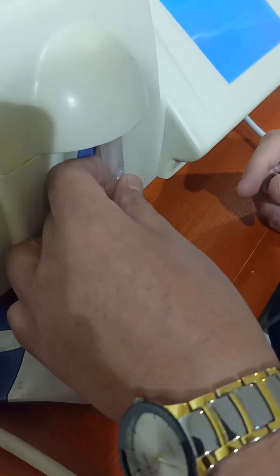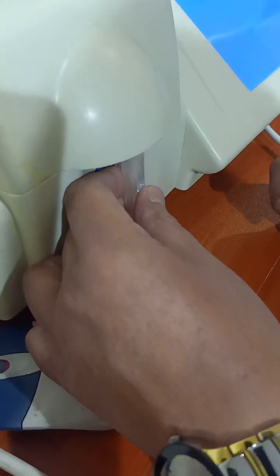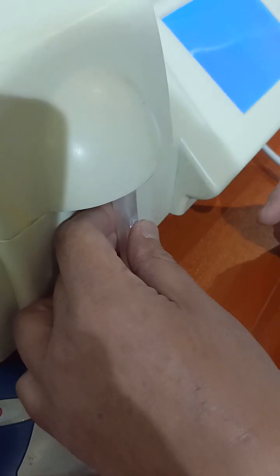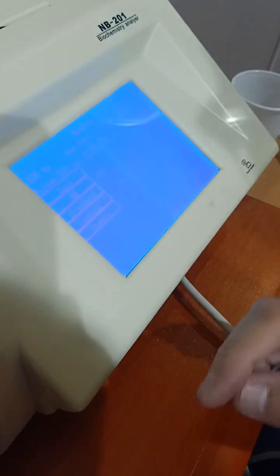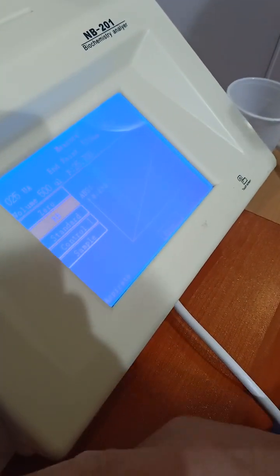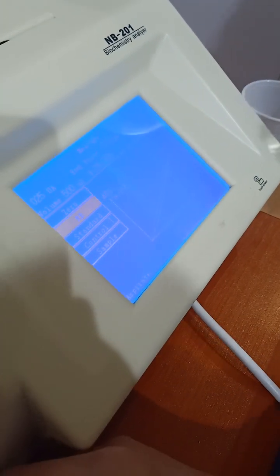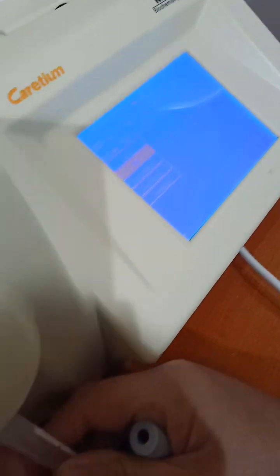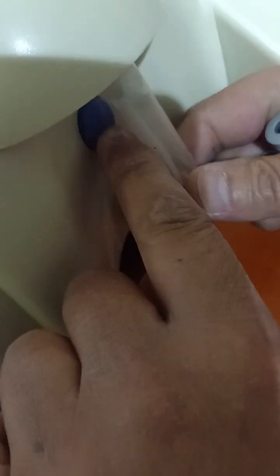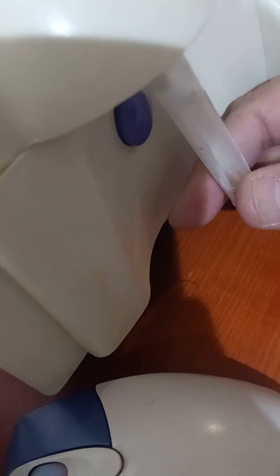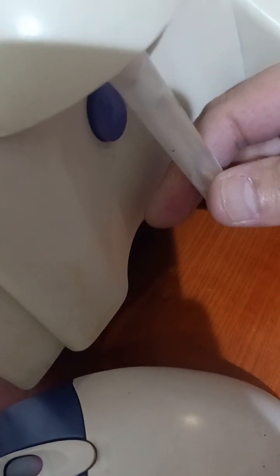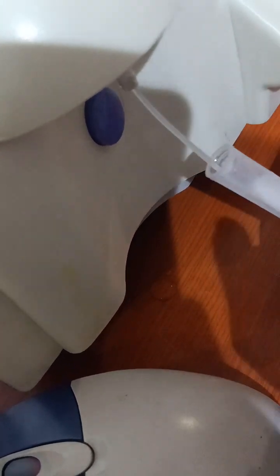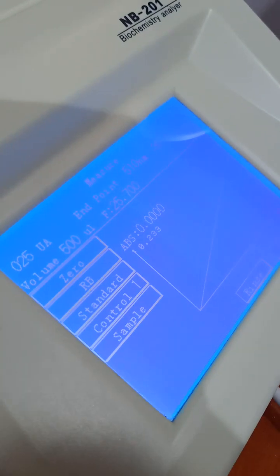It will take 25 microliter from the blank. Just, I push here. Here is the key. To take one, 25 microliter. To make zero. Now, absorbance for the blank is zero.